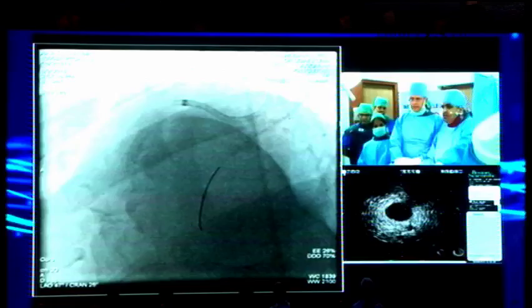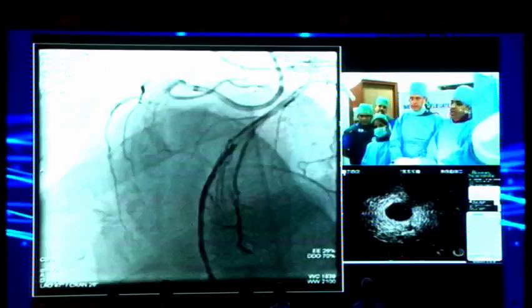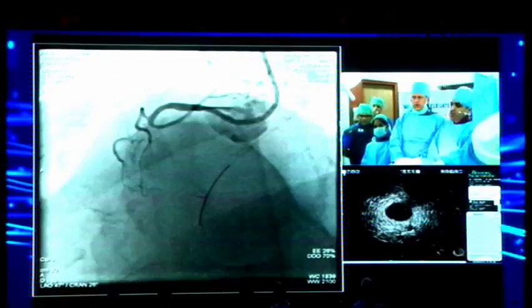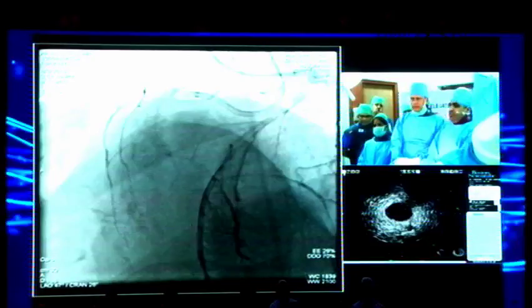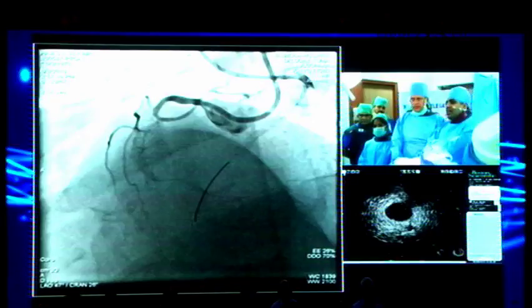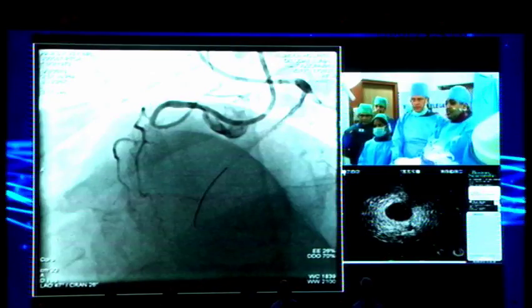And here you see a blind stump, not heavily calcified, but an already occluded stent for a long term. Fortunately, there is a side branch, maybe a big side branch. That's why it was not good for the antegrade attempt last time. So we discussed with the doctors here whether to start again retrograde or antegrade with IVUS guiding techniques.